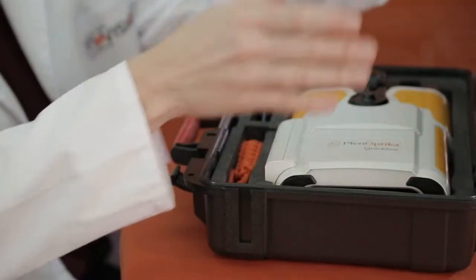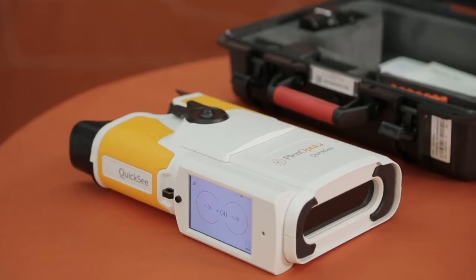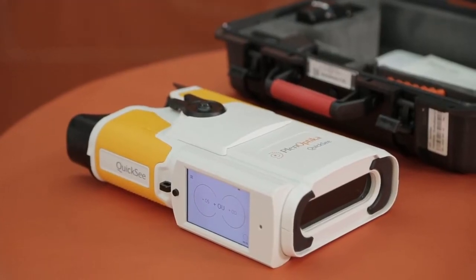Welcome to using QuickSee, PlenOptika's binocular easy-to-use wavefront refractor, which enables you to autorefract your patient in only 10 seconds.